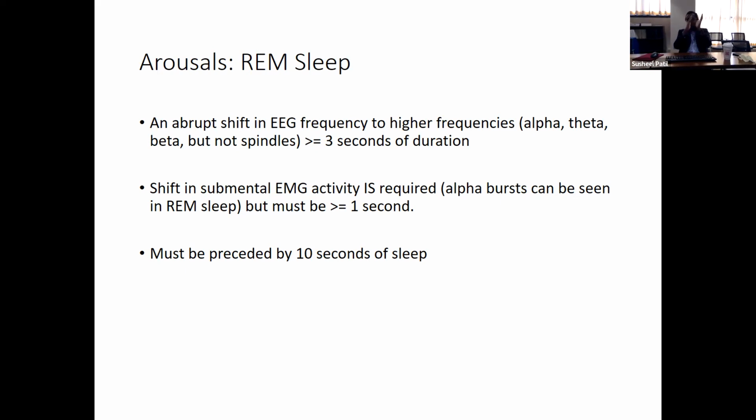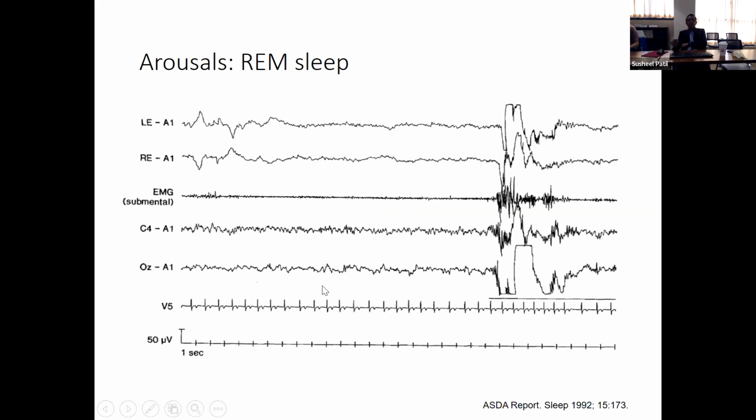So when you're in REM sleep, we start to focus on the EMG and particularly identify those arousals. So that's really the only difference you need to know between the two.